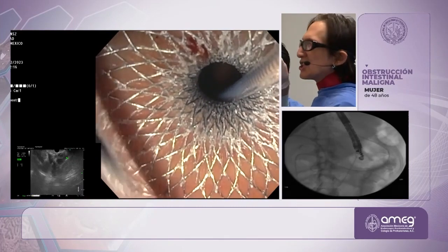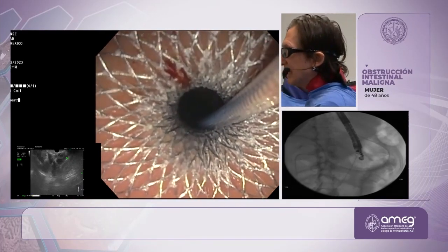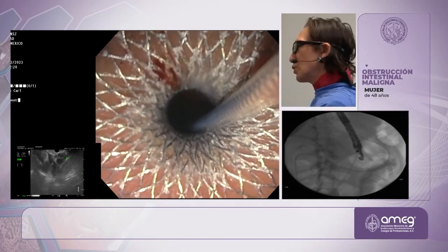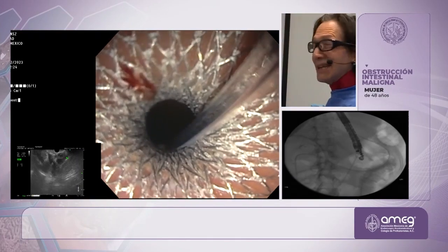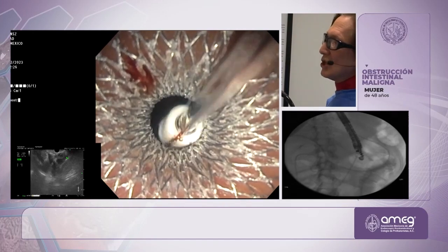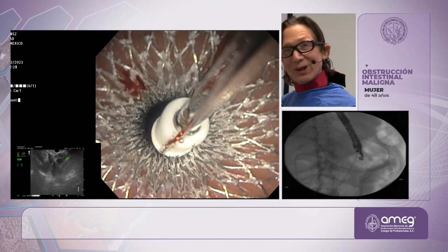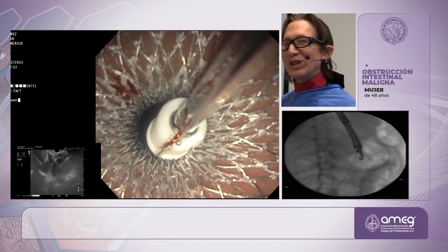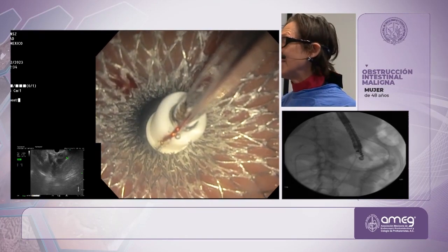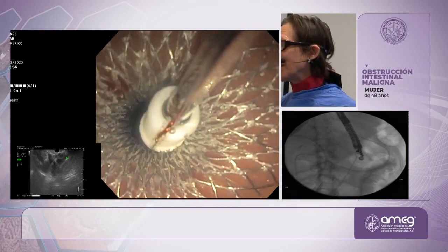Now, you can just sit here and look and make sure that when you remove, this is the inner catheter that is connected to the nose cones. You see the micro wires there? Those are those wires. This is the genius of the engineers at Lumina, the company that I founded when we developed Axios.